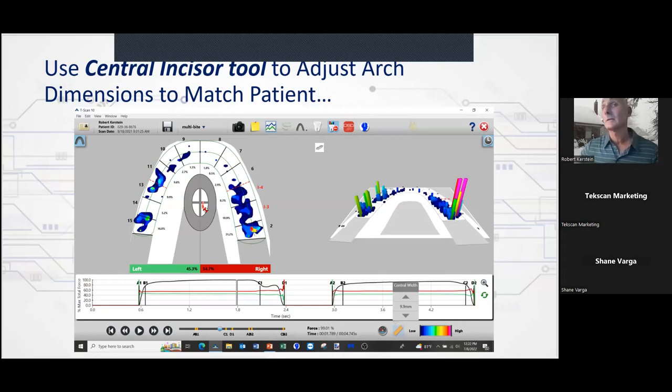So if I go in and mark the teeth with articulating paper, the marks I'm looking for are the central fossa of 2, the most distal buccal mark I can find, this one on the distal marginal ridge of 11, or maybe between 11 and 13, almost exactly there. This would be 13 to the buccal. This would be 15 and 14 shared on the marginal ridge. This would be distal fossa. And those are the things that you can only do with the marks if you set up the dental arch correctly.